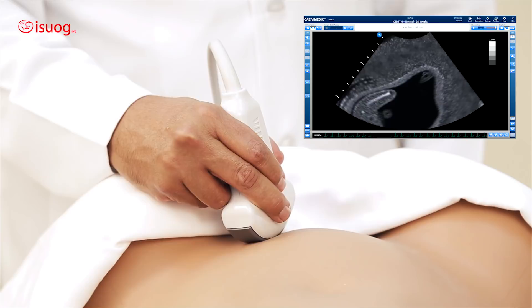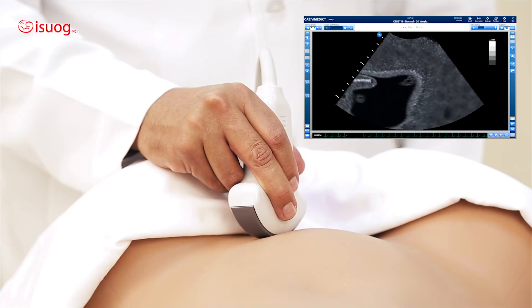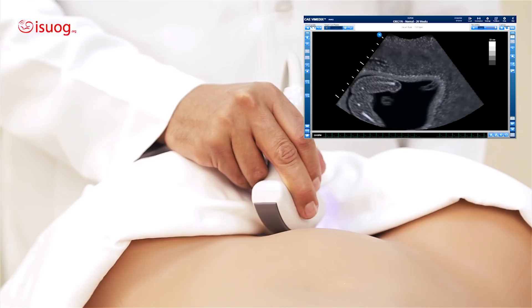However, the femur is now not in the center. That's why I need to slide on the narrow — to get my target in the middle of the screen. And now I have the femur horizontal and in the middle of my screen.